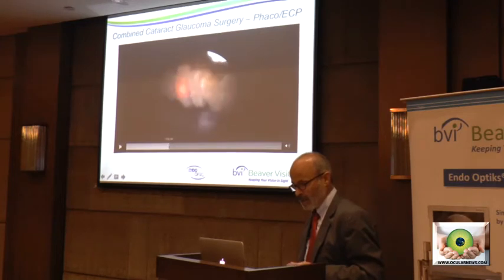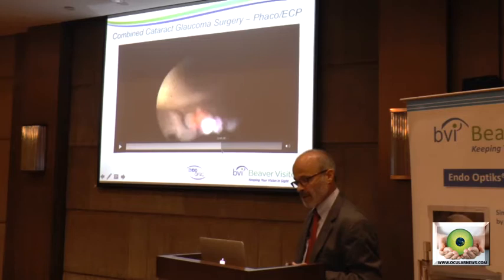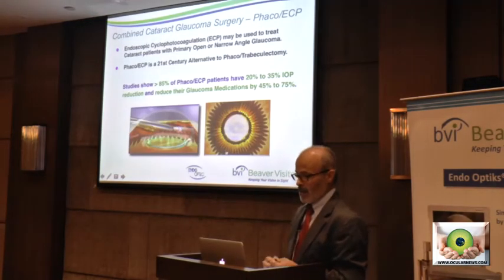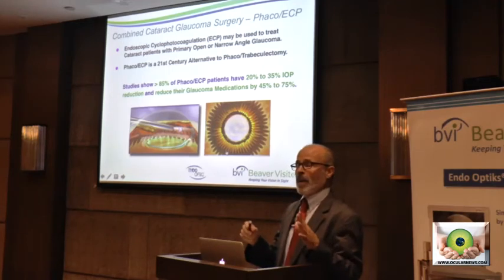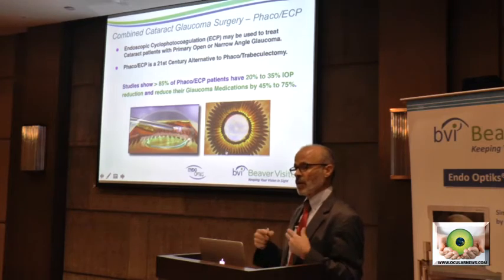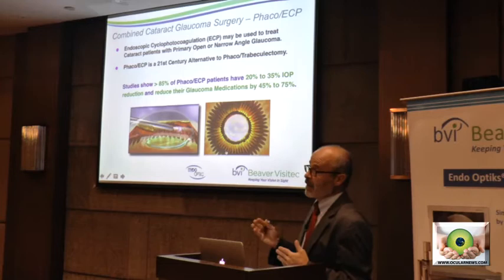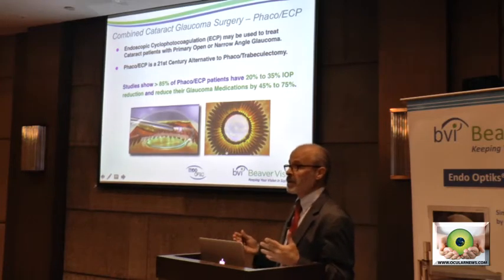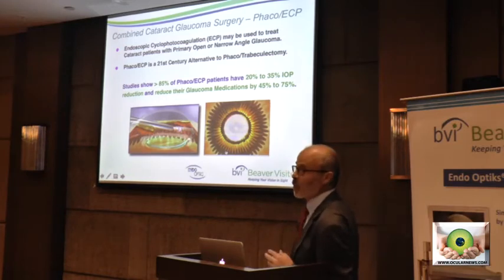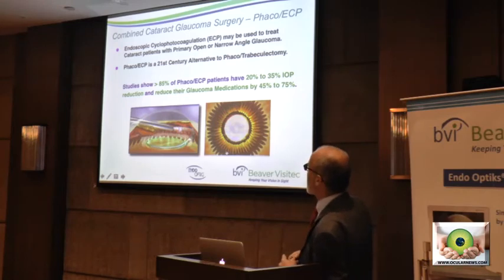Grab it again. Just to show, in real time, this took about 3 minutes and 20 seconds for him. I'm always astonished here in India to see how fast, how skilled your cataract surgery is, how quick you're getting these patients in and out. And a combined procedure where you can add a couple of minutes to treat the glaucoma component as well, maybe something that's well suited here to your high volume of quick practices.